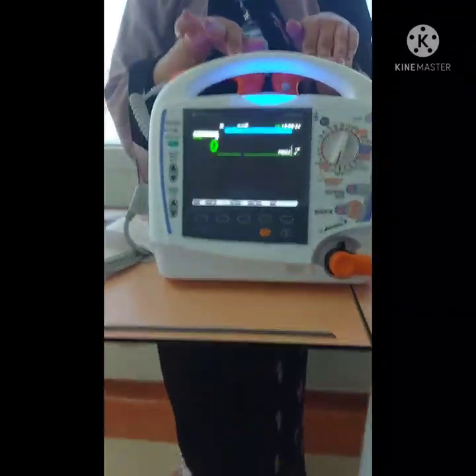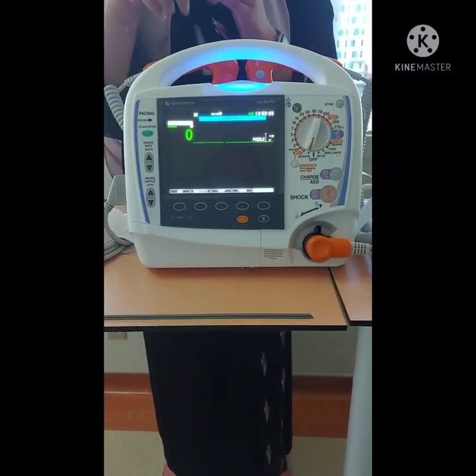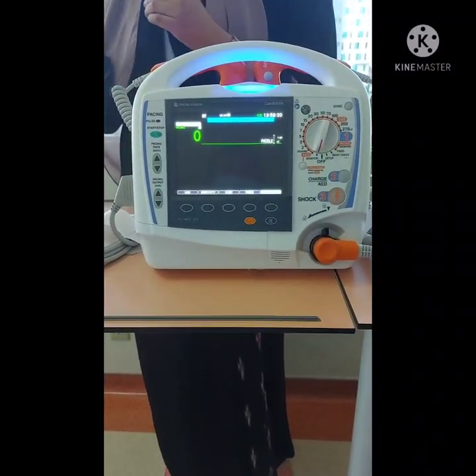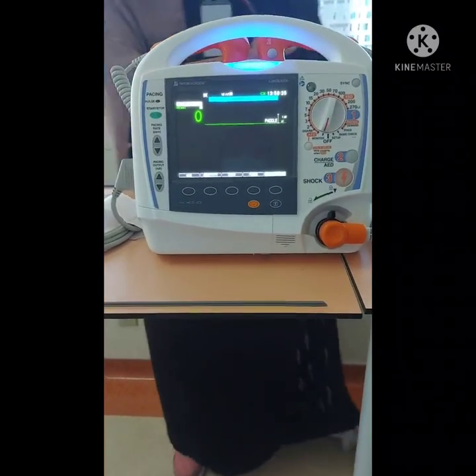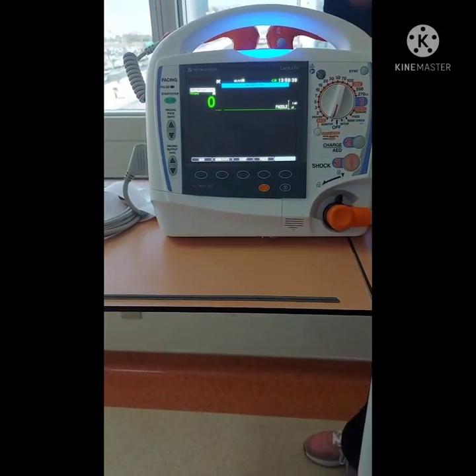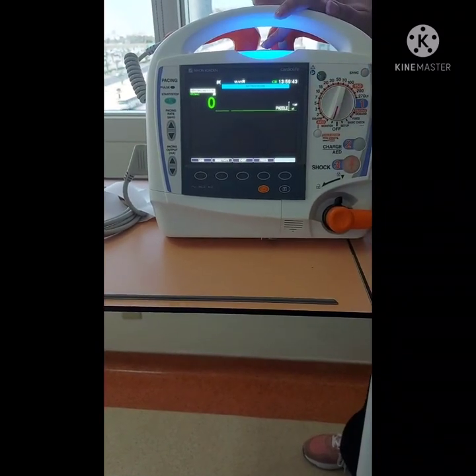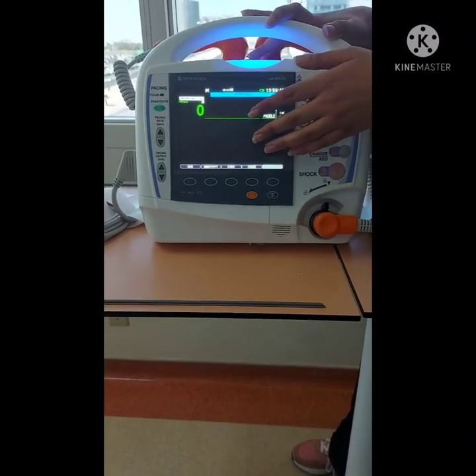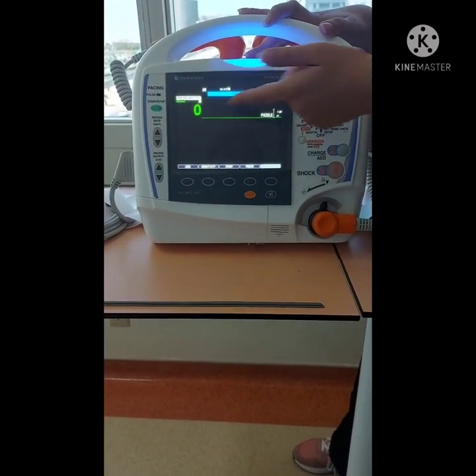It has three different colors. And four different colors actually: blue, orange, red, and green if the patient status is stable. Blue is the normal, when you turn it on, it's just not connected to any patient. So if you want to put the synchronization or anything, it's not going to show you anything here because there is no waveform, it's not connected to a patient.